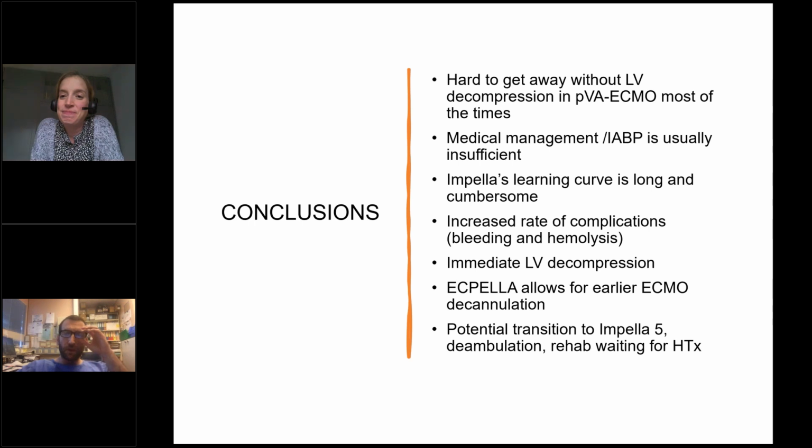Okay. Now, there's a question of one of our participants who writes that he has witnessed that some of these patients in pulmonary edema, once they go to additional Impella support, their already somehow manifest Harlequin syndrome may at first become even worse. And you mentioned the role of Harlequin syndrome in these patients. What's your tip on how to counteract that and how to deal with that situation?